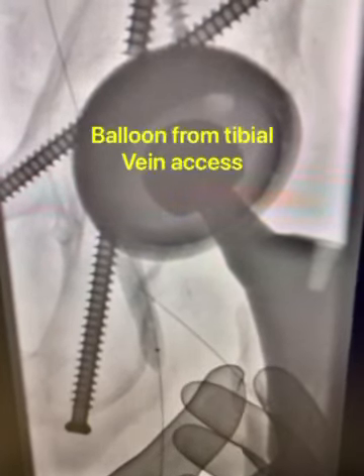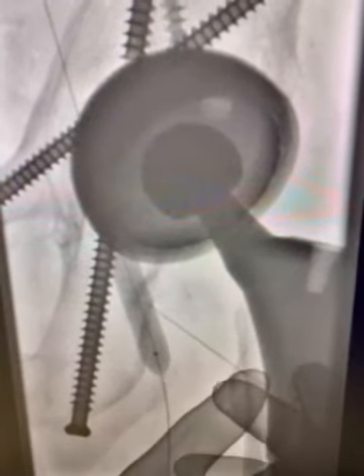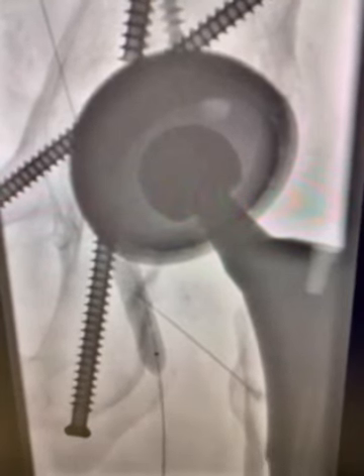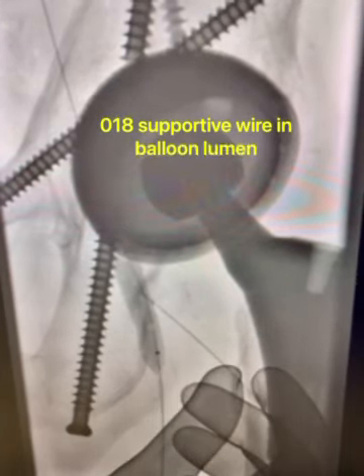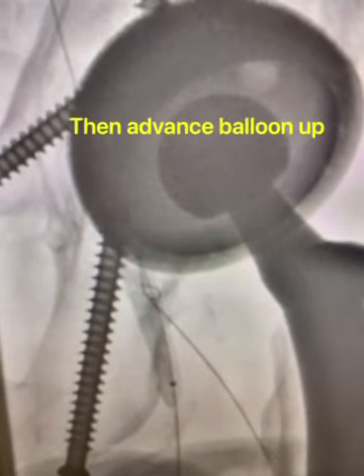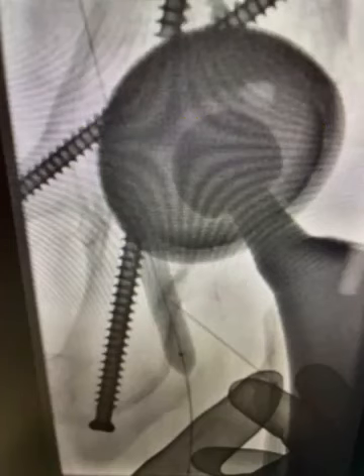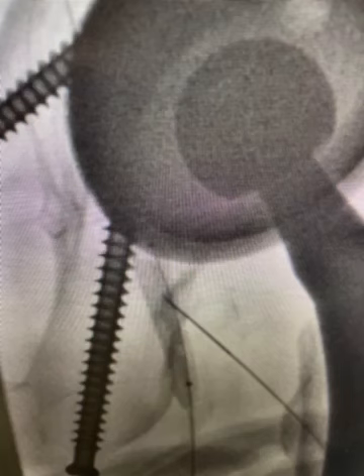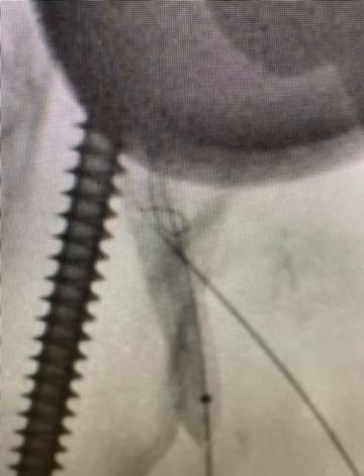You can see here when it's a manual feel when the balloon actually gives, and it's a fluoroscopic finding obviously when the needle hits the balloon, at which point a supportive 018 wire is advanced within the lumen of the balloon itself and looped within that lumen, and this will allow the entire balloon to be advanced forward into the iliac vein from the tibial vein access in order to gain some ground for the placement of a sheath into the common femoral vein and iliac vein stenting.